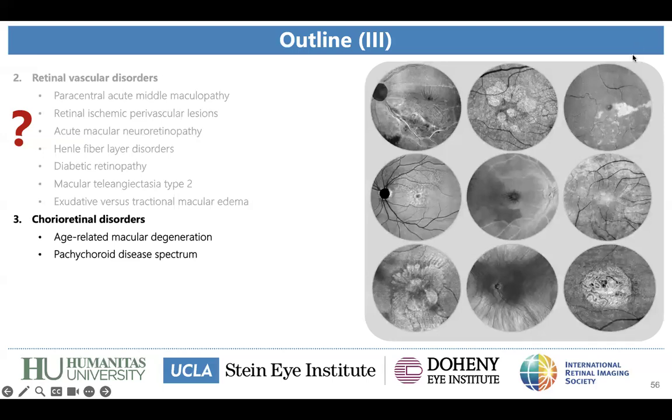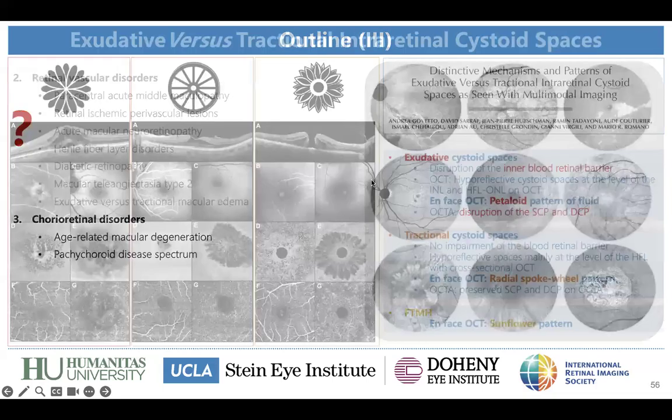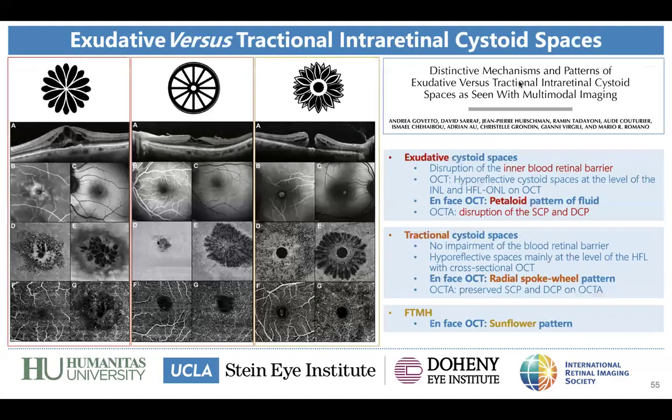Well, I just loved your final explanation about the pattern in the cystoid space. We were just yesterday discussing a patient, and we were trying to figure out if this fluid was exudative or tractional. And now I want to check again and look for it.